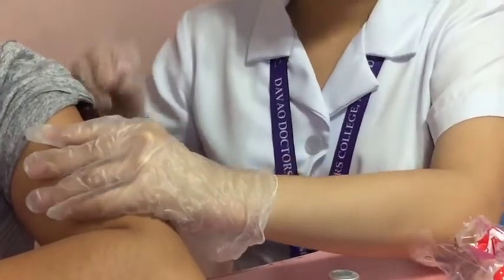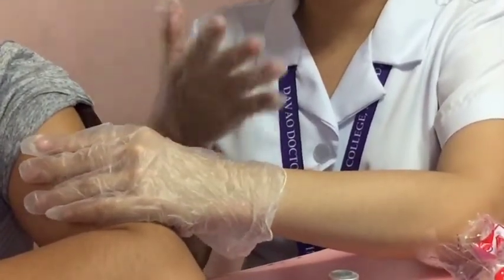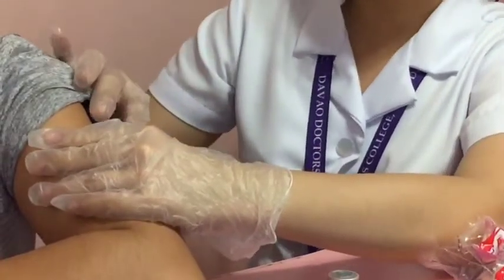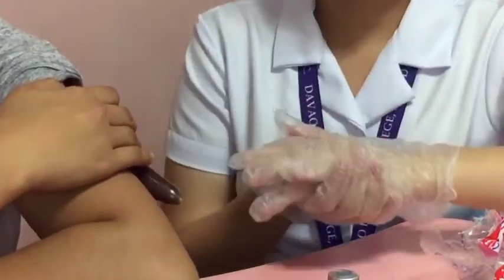So now, let the client hold the cotton ball. So ma'am, pwede niyo munang hawakan ma'am. Then after this, dispose of the supplies appropriately.